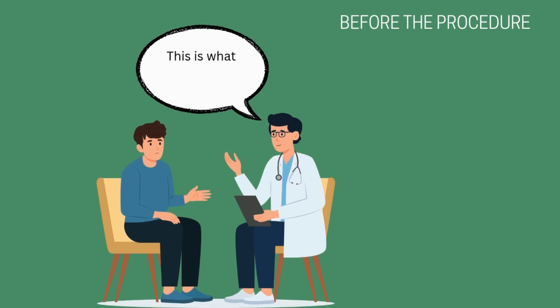Always explain to the patient what's going to happen. This will keep the patient's anxiety low. You might say things like, "I'll clean the area, place a small needle, and collect a few tubes. It should only take a minute." Let them know they should speak up if they feel unwell at any point during the procedure. Offer small choices when you can, like which arm to use, or if they'd like a countdown.